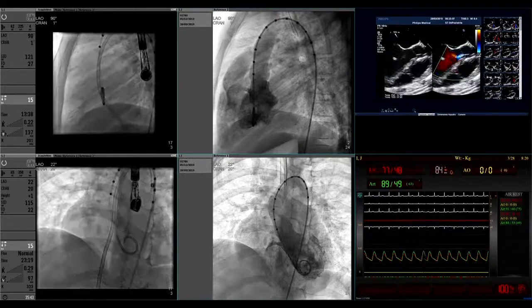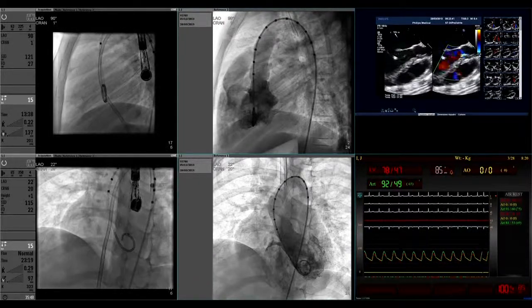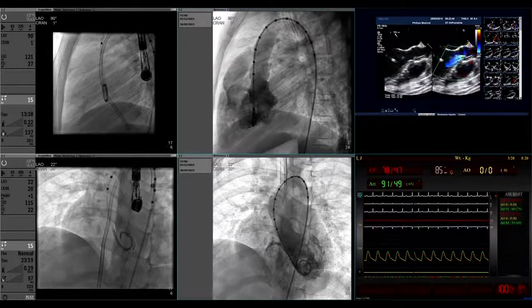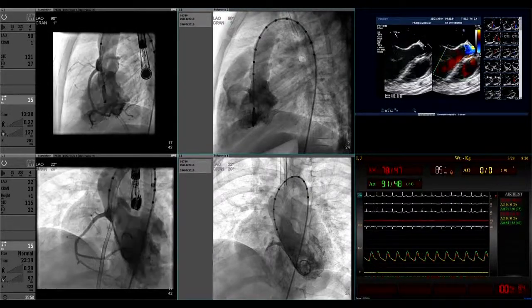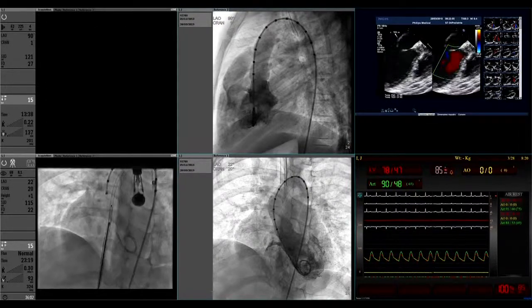The symmetric device, the two discs are separated by 3 millimeters. Yeah, I think so. So there will be some amount of clamping by the two discs. Well, the LifeTech device is softer than the ADO1. There's no doubt about it. So, you know, you cannot have everything in just a single device. You have to give and take.